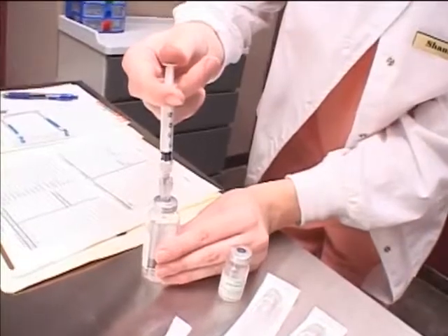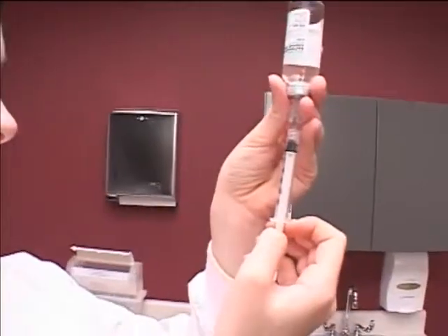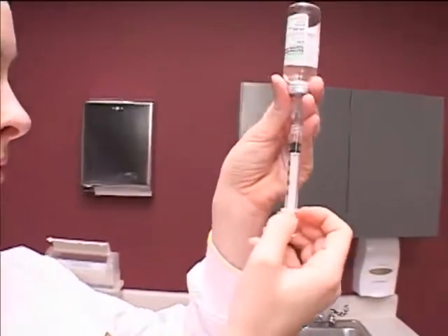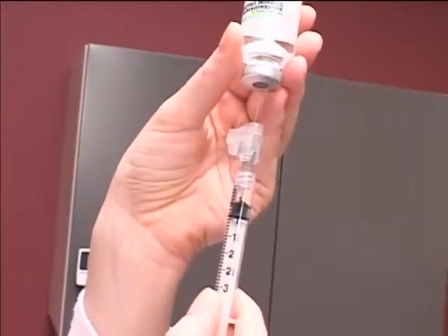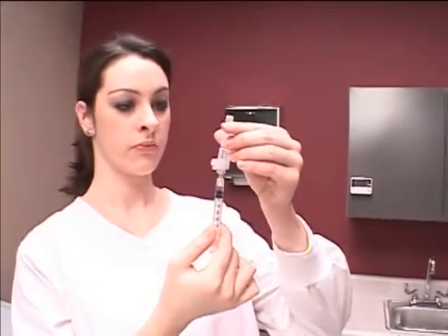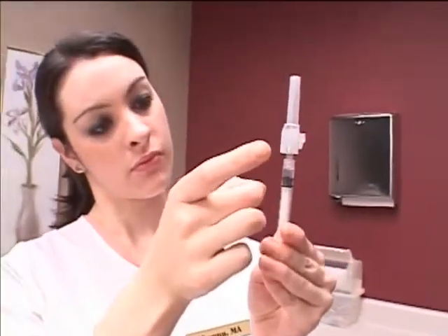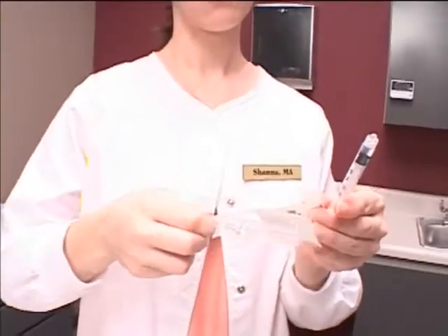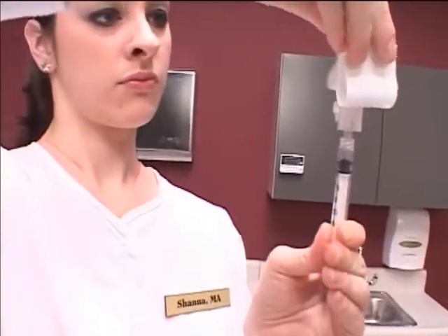Next, draw air into the syringe equal to the amount of medication to be drawn up from the first vial. Inject air into the first vial, then invert the vial. Gently pull back the plunger until you reach the desired amount. Remove the syringe and recap the needle according to institutional policy. Flick the needle to remove air bubbles. Change your needle. This will help to reduce the risk of medication from the first vial mixing into the second vial.